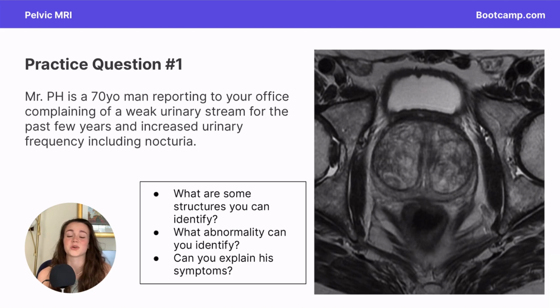All right, so I know we covered a lot of ground today, but let's go into some more fun practice questions. So Mr. PH is a 70-year-old man reporting to your office complaining of a weak urinary stream, an increased urinary frequency, including nocturia, for the past couple of years. So this is kind of an ongoing problem. And I want you to take a look at his imaging here. Talk to me about some structures you can identify, what abnormality you might be seeing, and what you think is going on. So take a minute, pause this video. Otherwise, I'll go ahead and give you the answer.